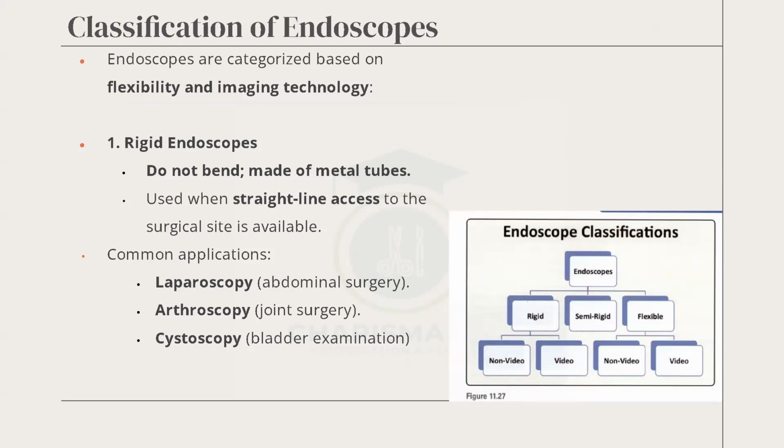Okay, classification of endoscopes. We have flexible endoscopes and rigid endoscopes, and in some cases you can also find semi-rigid endoscopes.